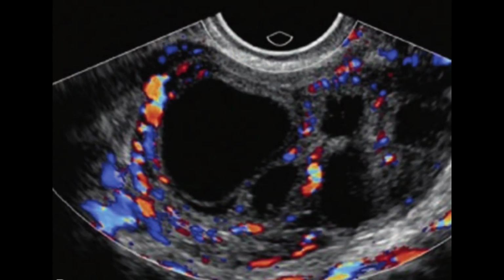There are thick septations within it, with vascularity still visible here. So this is a tubo-ovarian abscess, a complex, large mass having cystic components, thick septations, and vascularity. This is a feature of tubo-ovarian abscess.